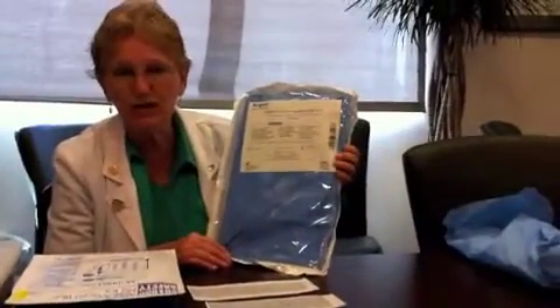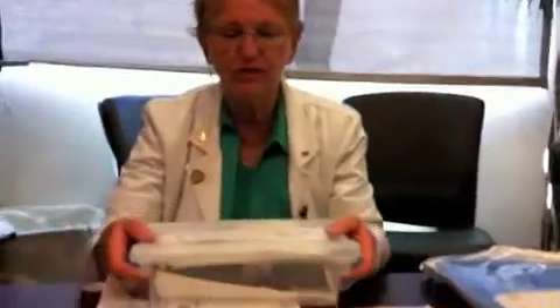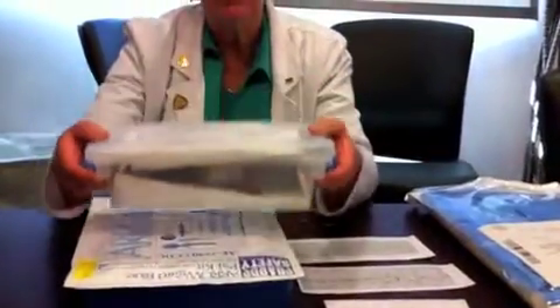You need this transvenous pacing electrode tray. This is called an introducer, and down by where the triple lumens are, this sits adjacent to the triple lumens — the doctor puts it in like a central line. And then the third thing that you would need is the pacemaker generator, which comes in this little box.